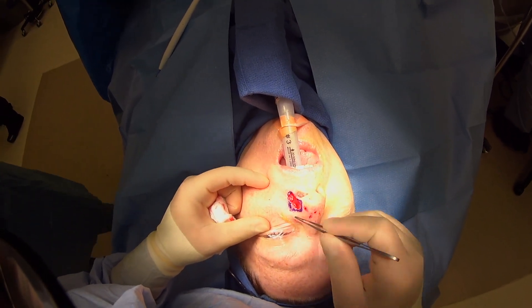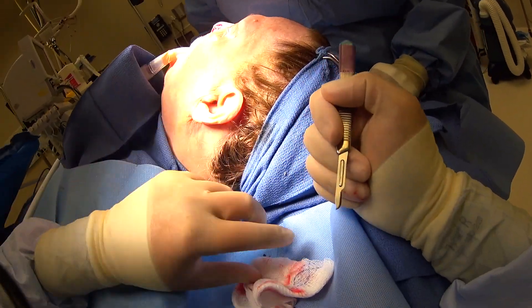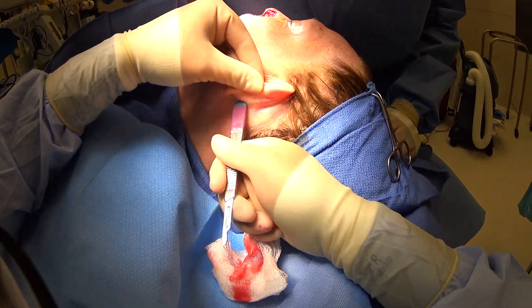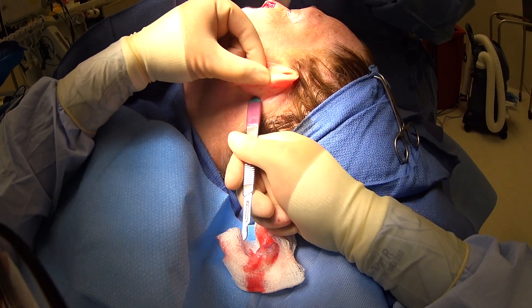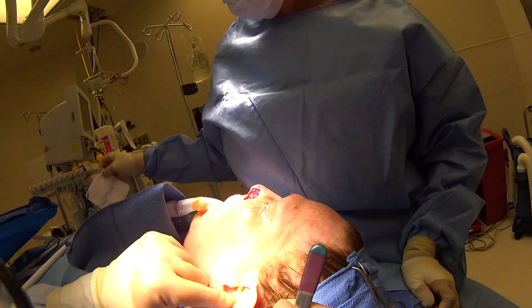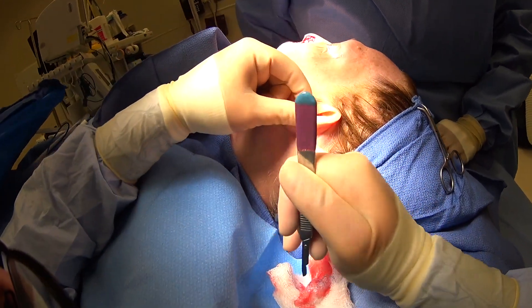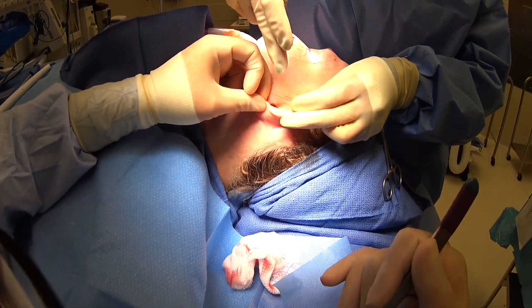Now we're in the back of the ear. I'll show you the defect we cleaned out. We're going to take some cartilage graft — just like we do for a facelift, we'll hide our incision in the back of the ear, then free up all this cartilage. The portion we're taking is from the base of the ear, so there won't be any visible difference in the shape of the ear and the incision will be well hidden behind it.